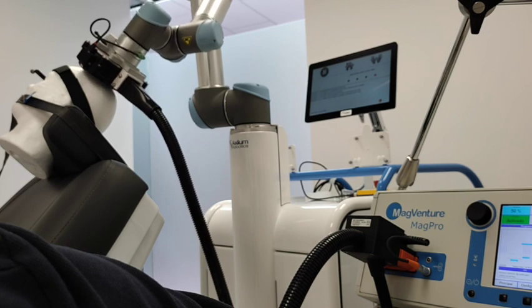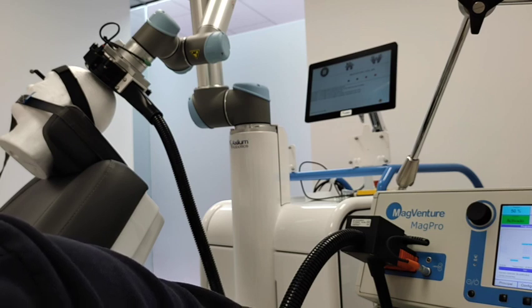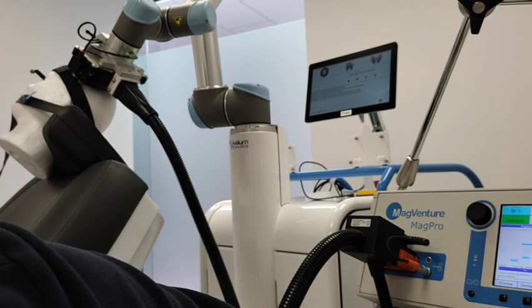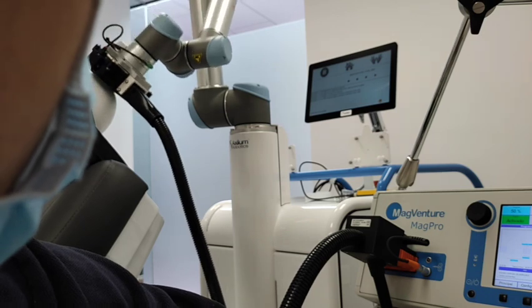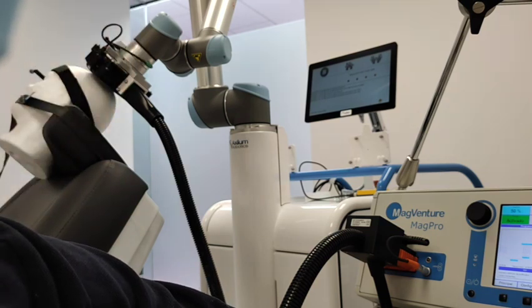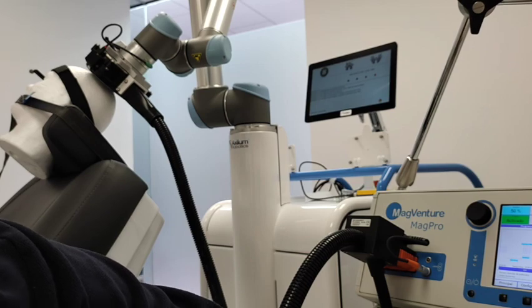Now, for instance, it's moving to the next target. And now to the next one. And so on.